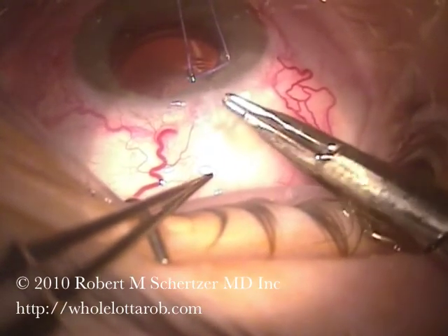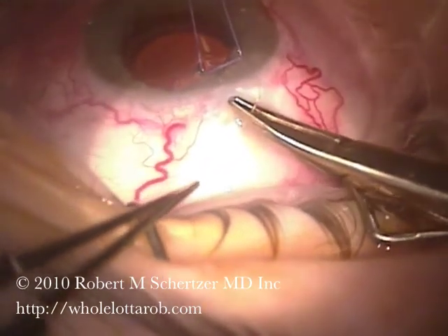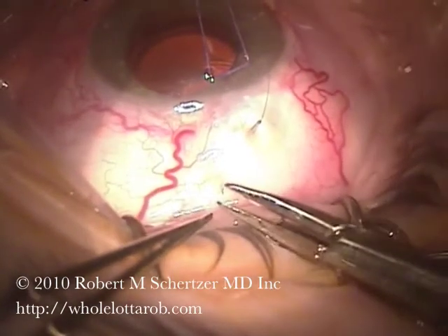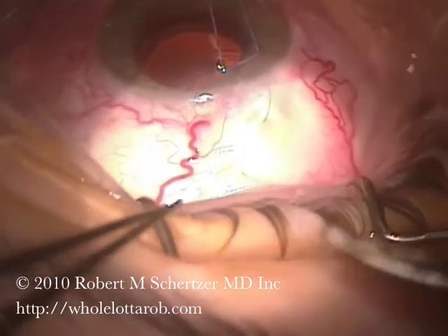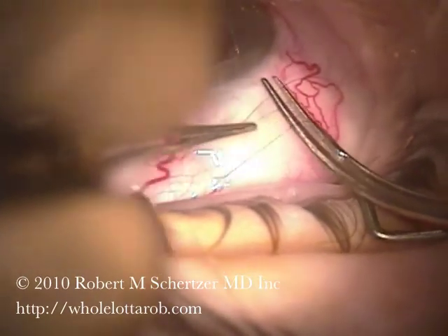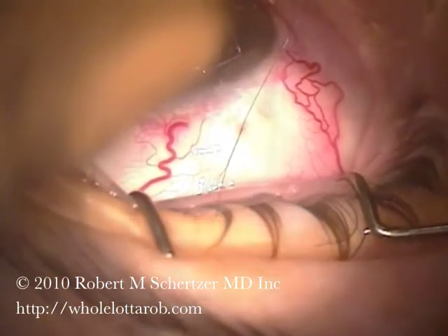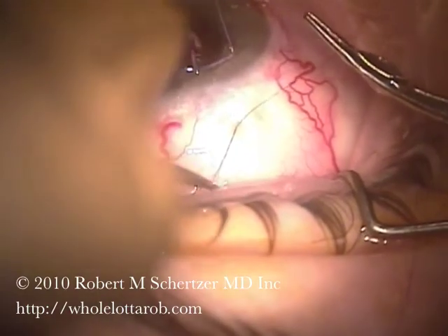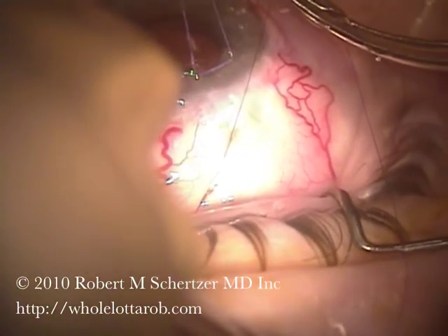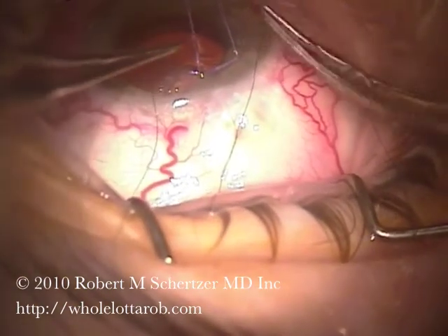This is a 10-0 suture going right through the conjunctiva, into the scleral flap, and then out the other side. This has been well described in the literature. Then tying the suture in the usual fashion, with three throws, and then one more, and then one more after that, to provide a very tight closure.